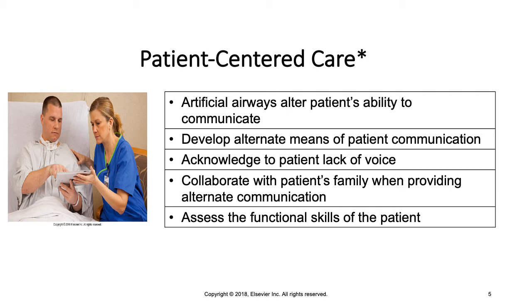You want to make sure that you explain everything that you're doing, that you let the patient know what to expect, because if you do that, that's going to decrease a lot of apprehension. If this is something that is new for the patient, they can be quite fearful and frustrated and anxious at times, just as they get used to it. It could be a temporary thing or it could be a permanent thing.